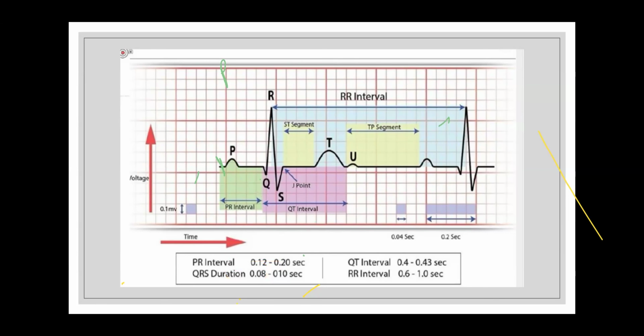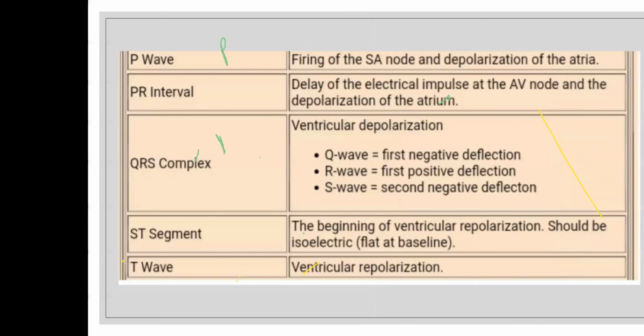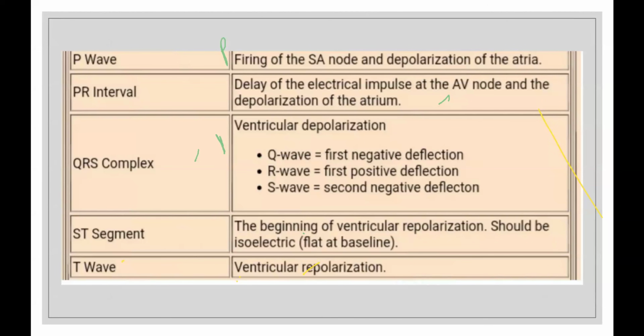Now they have shown you the durations as well, and we will discuss the durations as we cover more. This slide is basically a repetition of what we have already covered.